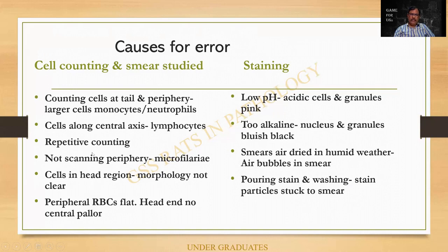Not scanning the periphery. In fact, I am supposed to scan the slide under the low power or even the high power to rule out parasites such as microfilaria. Microfilaria is an exam slide that will be kept under the high power, not under oil immersion. The cells in the head region will not be spread out, and therefore the morphology cannot be clearly made out.